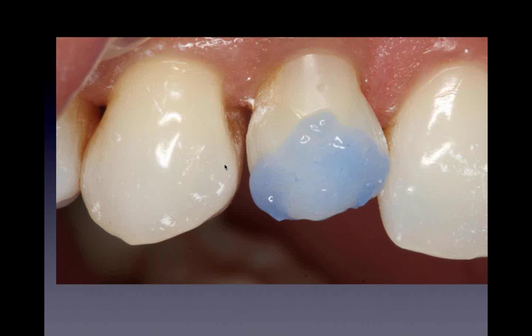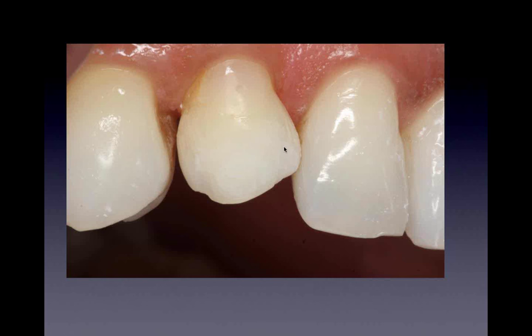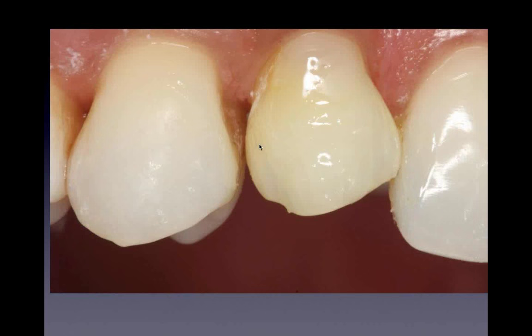So we go ahead and etch. Here's the preparation, a nice semilunar preparation, wrapping around the lingual. Remember, I want to get nice structure on it. Every now and then, I just want to make a note of this: if I have a grinder, bruxer, or extreme clencher, I may even go into the enamel here and make a U-shaped preparation just to hold the composite mechanically. In this case, I didn't have to, but I wrap around the facial and I wrap around on the lingual.